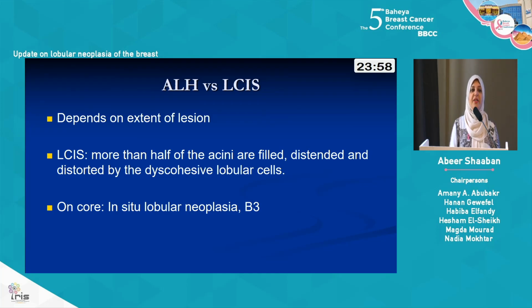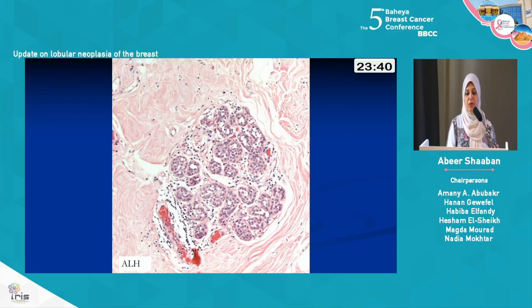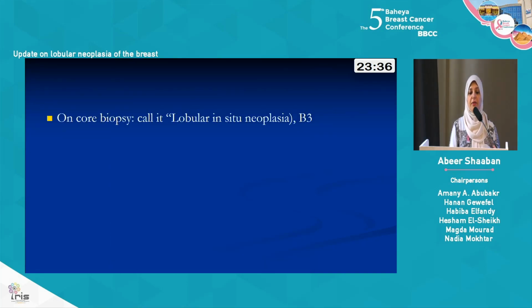On core biopsy, it doesn't really matter what to call it. So we tend to use the terminology lobular in situ neoplasia to encompass both. Both are B3, both are managed the same. So whether you think it's ALH or LCIS on a core biopsy really doesn't matter, but on the excision, try to make the distinction. And this is an example of ALH rather than LCIS.